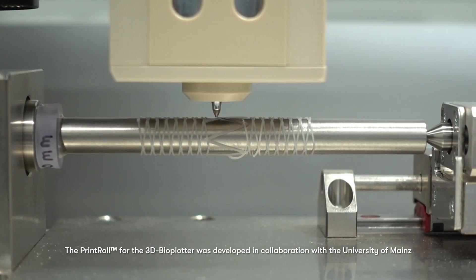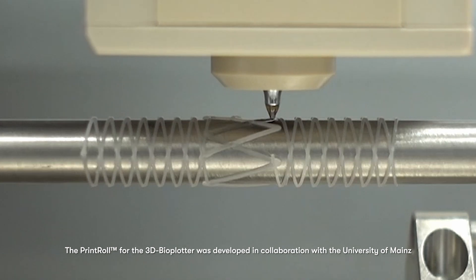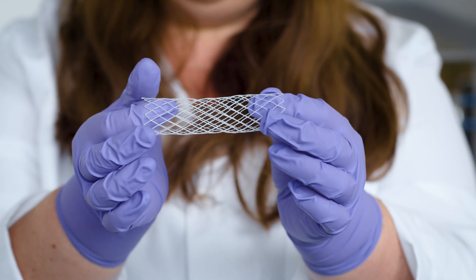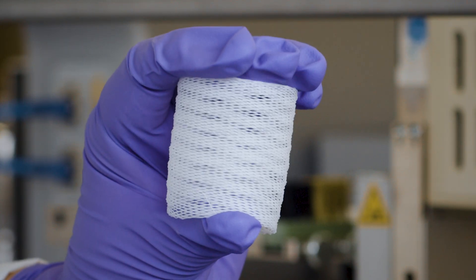With the Print Roll, materials are deposited directly on top of a substrate that rotates as the print head moves, enabling these structures to be patterned layer-by-layer into complex architectures and therefore expanding the palette of available materials.